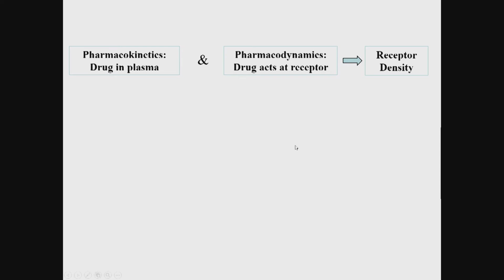But the very first pharmacodynamic effect is when the drug binds to whatever receptor, the alpha-2 receptor or whatever, that this antihypertensive agent uses. So we are measuring the very first step of pharmacodynamics, and that is binding of the drug at the receptor. And the combination of those two allows us to measure receptor density, which can be important if it's related to disease.